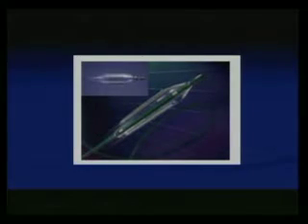So we have regular balloon angioplasties, and then this is a cutting balloon which has razors on the end, and it cuts the intima. Most of the time it's like a controlled dissection, and then after this you can do a drug coated balloon. Drug coated balloon, most of the time they have paclitaxel drug, which decreases the proliferation, and so cutting balloon and DCBs then.